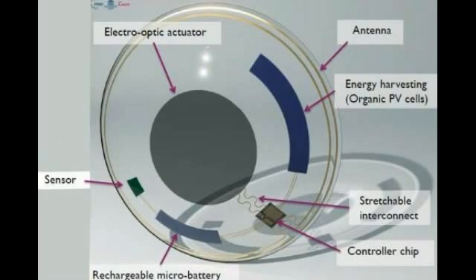In the center you have the electro-optic actuator, which is the display. Off to the right you have an energy harvesting PV cell to harvest light and charge the lens. Down in the lower right hand corner is the electronics and controller chip, and to the left is the rechargeable micro battery.